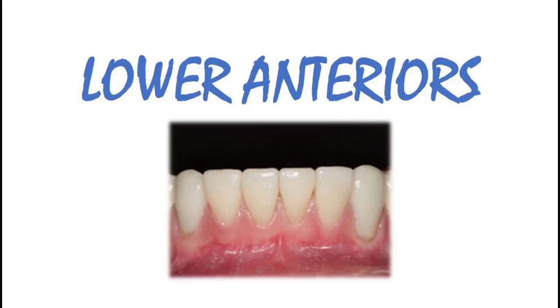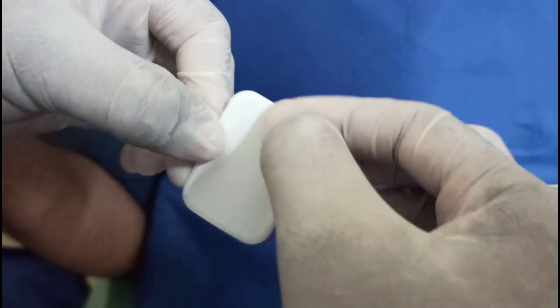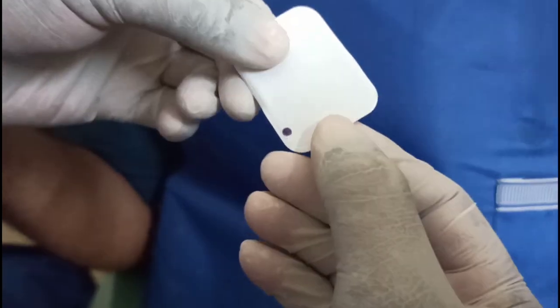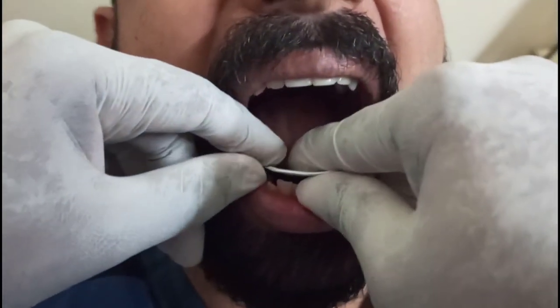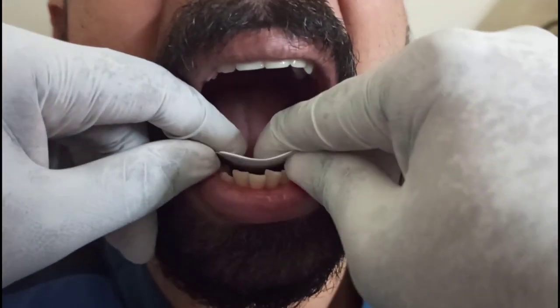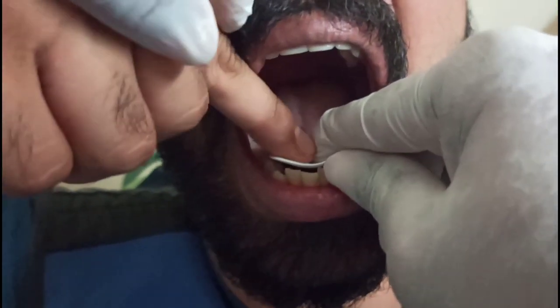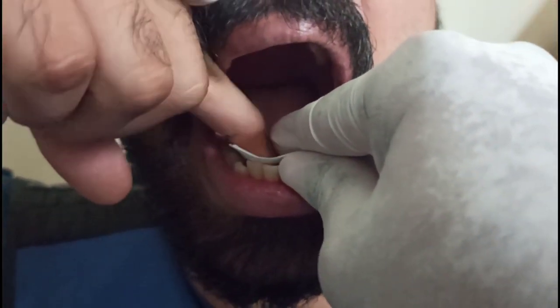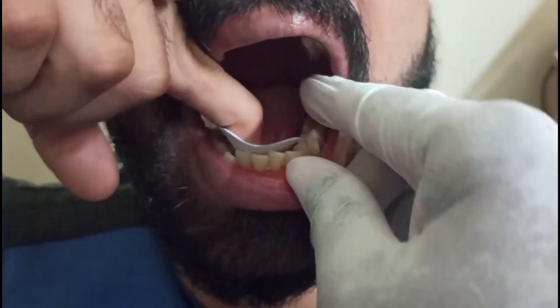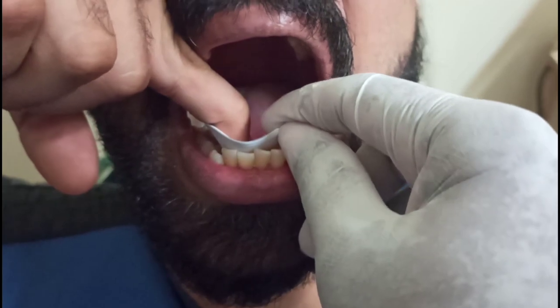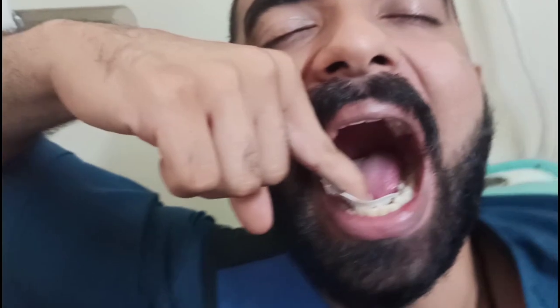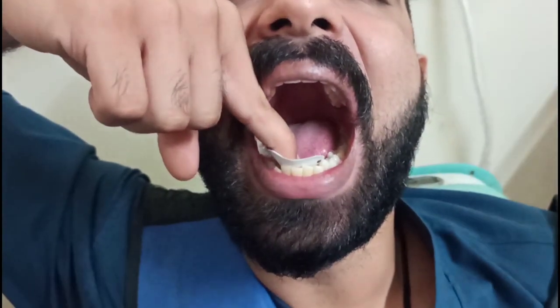Next is for lower anteriors: place the film so that 2 to 3 mm of the film is extending away from the incisal plane. The important thing is the patient has to raise his hand and then hold the film deep inside towards the tooth from the top. By doing this there will be no hindrance by the patient's hands when placing the tube.